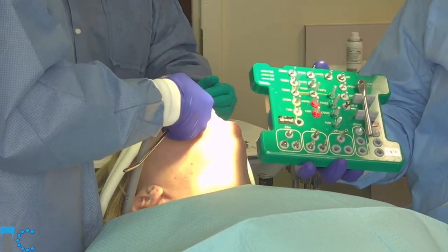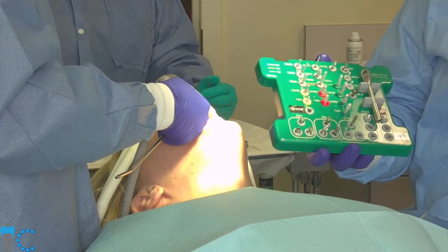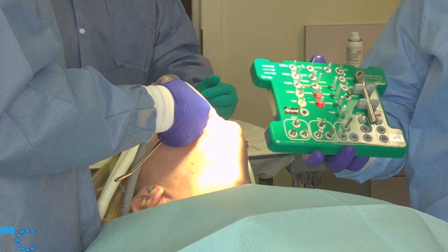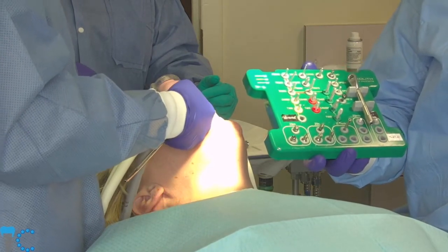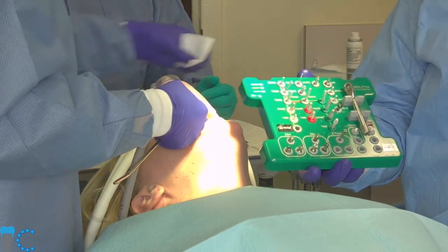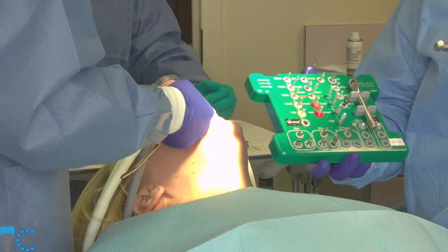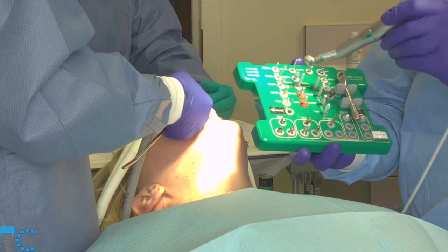I haven't discussed that one because it's a one-piece implant system. And the truth is we don't place a lot of those. We focus on the two-piece implants here for a whole lot of reasons, and mostly it's to increase our surgical success rate. After we place these implants, we have a very low failure rate because it's very hard for the patient to function on these implants. So if we follow the red pathway here, that's the one we're going to follow today.